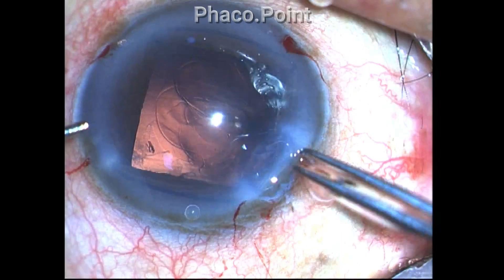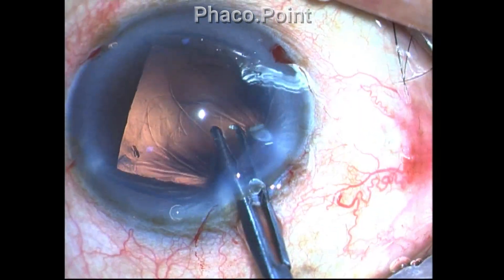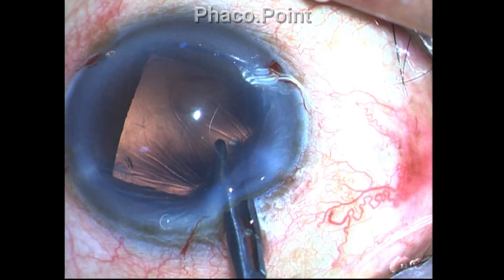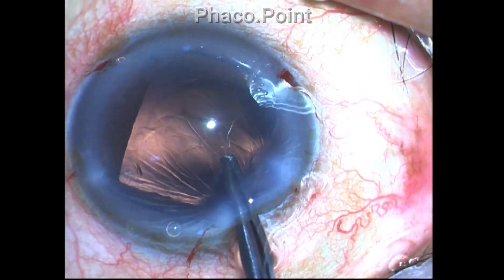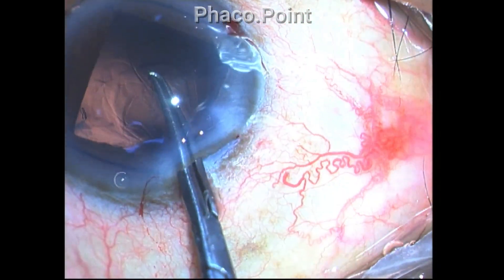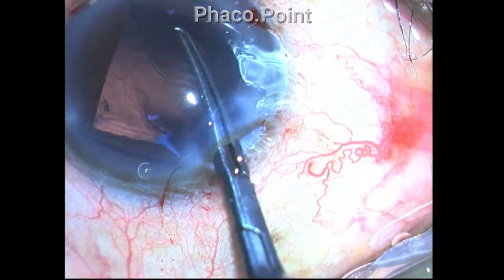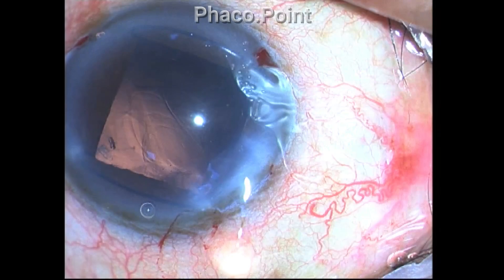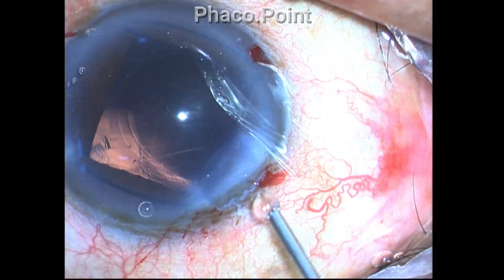I do it in two parts. First, I finish the nasal portion of the rent. Then I take the temporal portion of the rent, and I am able to convert this tear into a smooth oval opening in the posterior capsule.